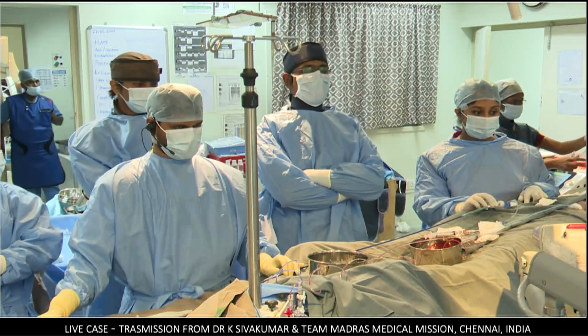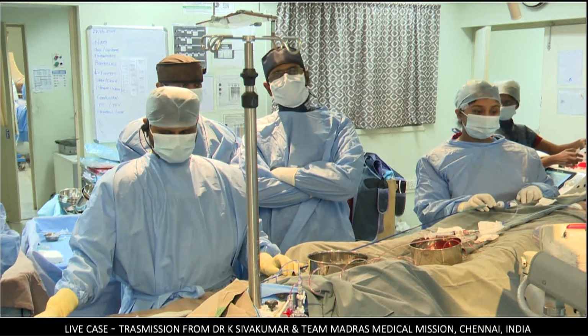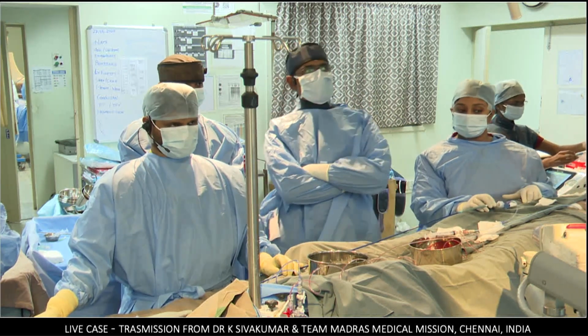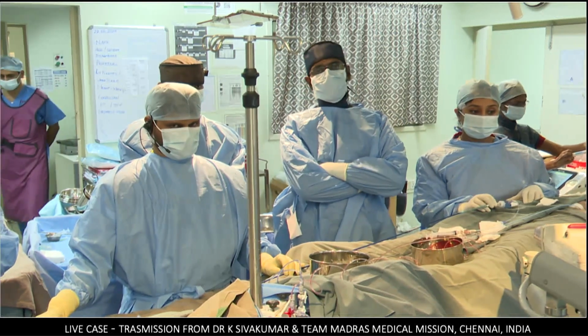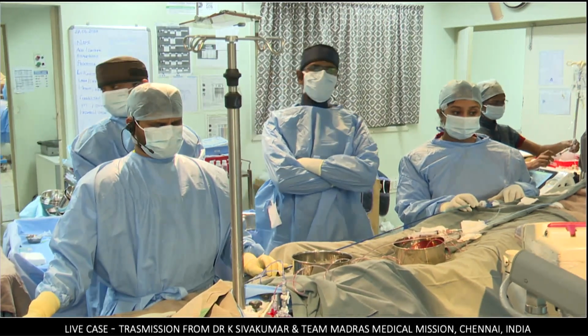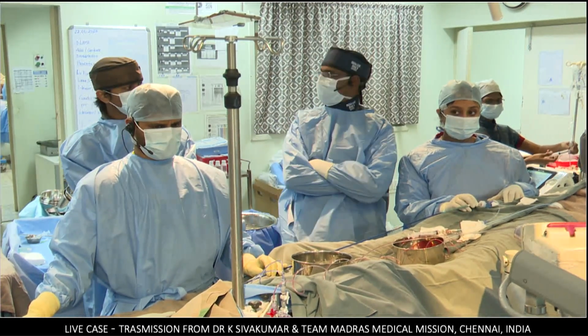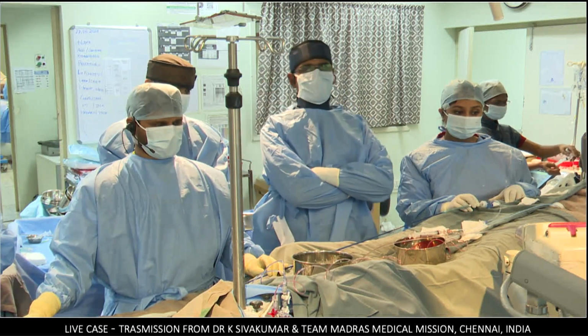Okay, Alison, this is an interesting patient. There is no previous cardiac surgery, but there is an idiopathic dilatation of the pulmonary artery with free severe pulmonary regurgitation. Regurgitant fraction is more than 65%, almost two-thirds of the cardiac output is regurgitating back into the right ventricle, and the patient is increasingly becoming symptomatic.